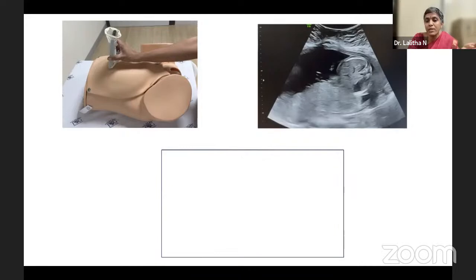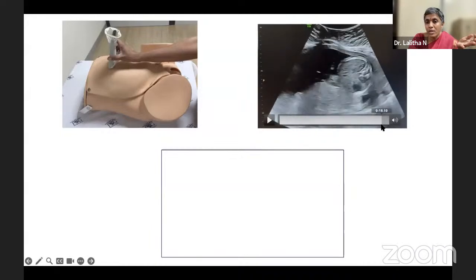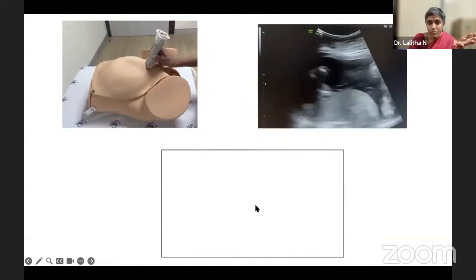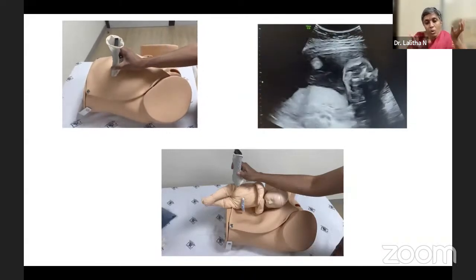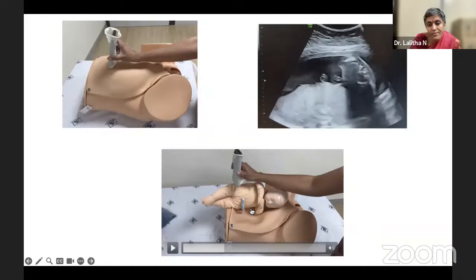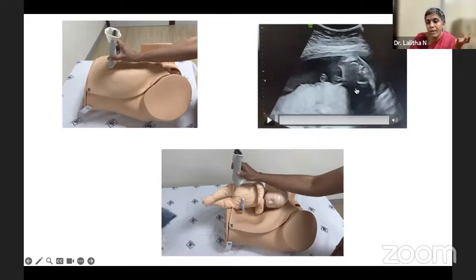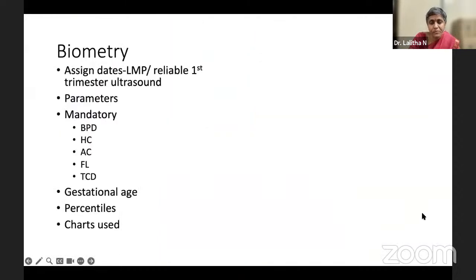This is very important in establishing the normal situs of this baby. As we move this video, we see that the heart and the stomach are on the same side, and it happens to be the left side of the baby. You can actually imagine the baby outside the abdomen, how it is lying. As we showed here, the baby is lying with its back to the maternal left, and the left side of the baby is down. And we establish the situs here by establishing the laterality of the fetus. Some people, when you start, use a Barbie doll or any rag doll. You place it next to the maternal abdomen in the orientation that you have imaged, and then you can establish the fetal laterality.